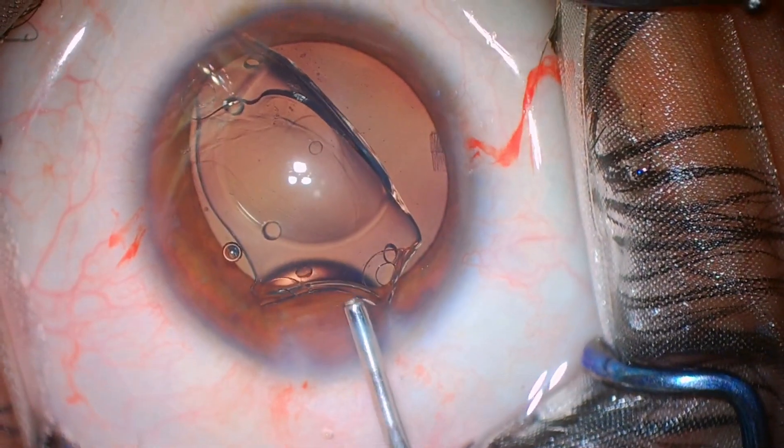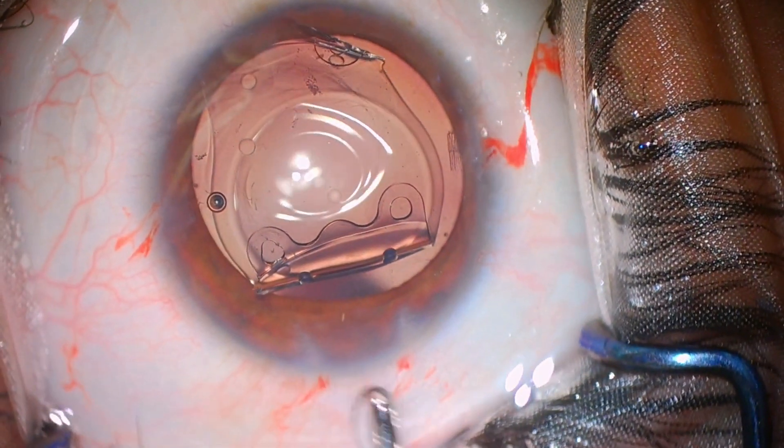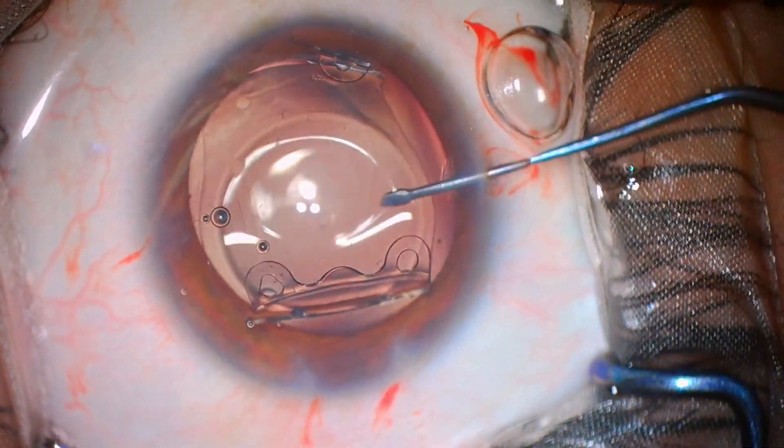Now, don't try to just rotate this IOL inside — don't do that. There is not enough space and you will injure the endothelium as well as the crystalline lens.